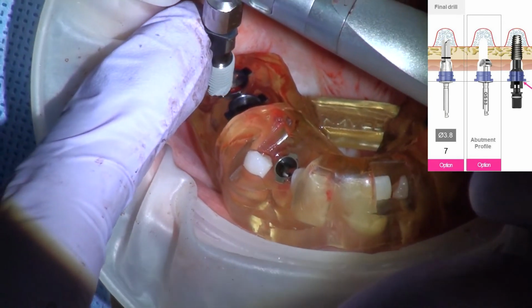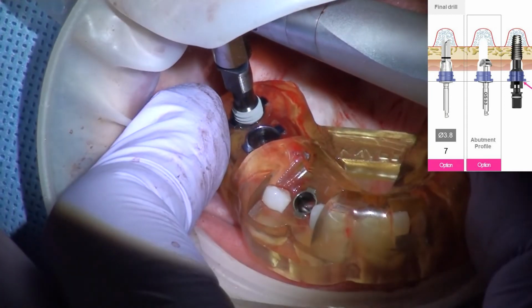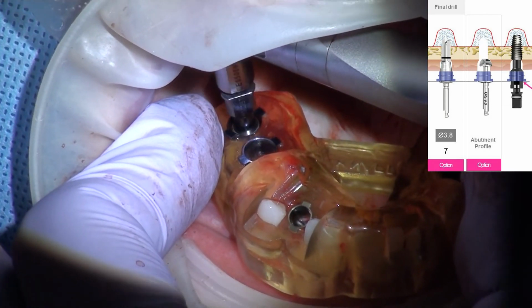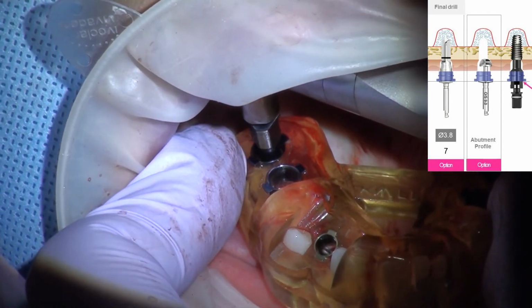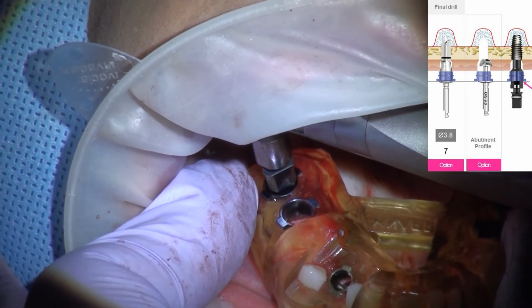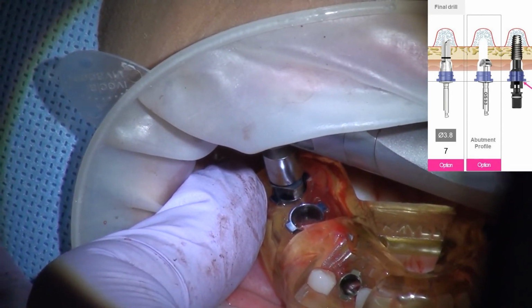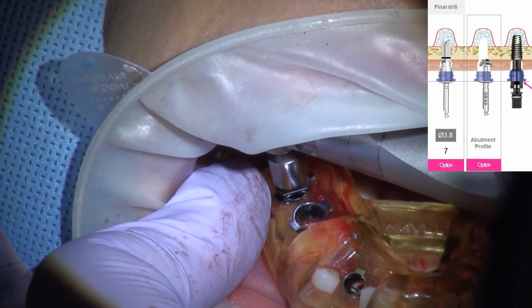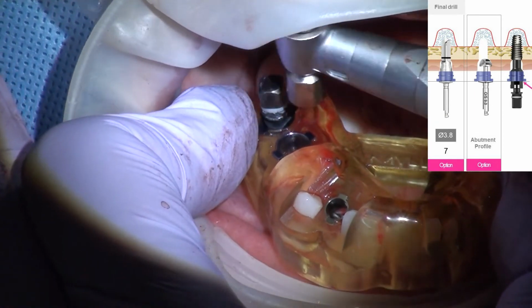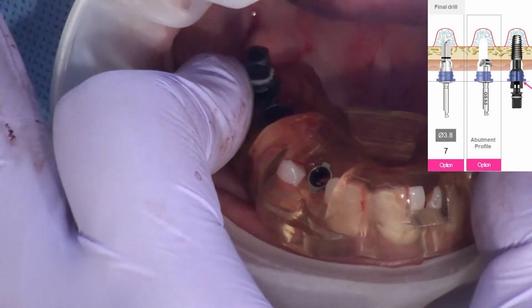Real big for me. These posterior ones can be a little tricky. Looks like we're going to get it in just fine though. Going to line it up. Go ahead and go pedal to the metal. Sometimes you'll get extra pressure right here. Beautiful, torqued out right at the final there. I love that. Let me get that out of there and we'll get an x-ray of both these implants together.